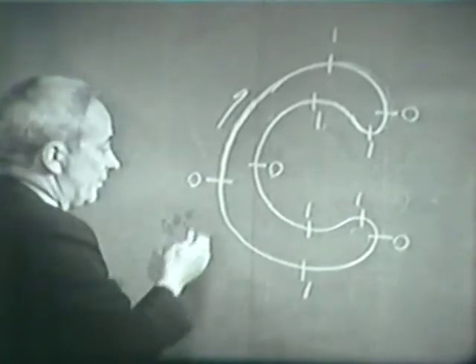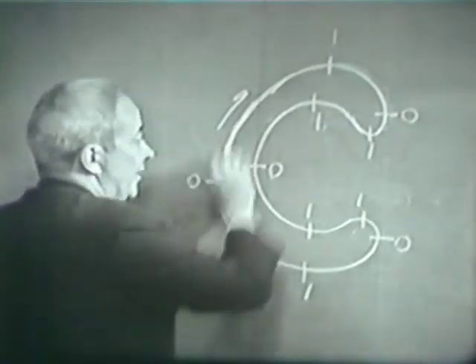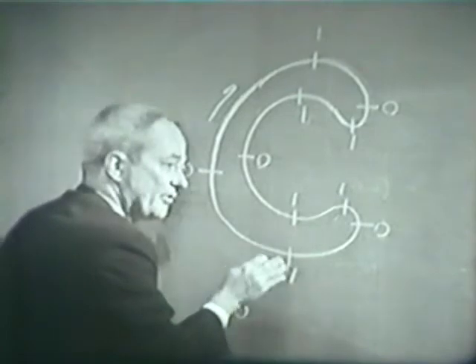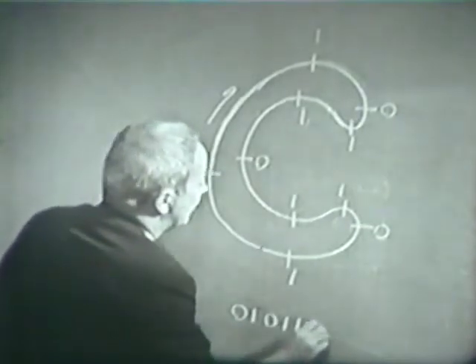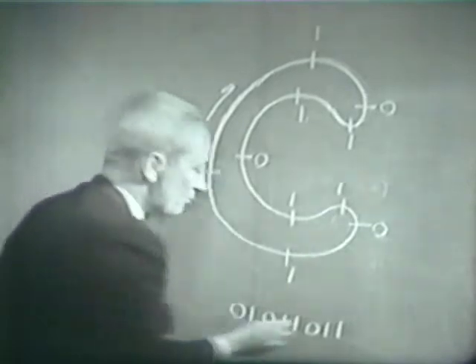Now, this scanner actually sneaks in from the left and finds the letter, and then it starts around. So it would start out here, and it would go 0. This is all that would be retained in the computer, plus a little bit of other stuff that I won't go into. A 0, and then a 1, 0, 1, 1, 0, 1, 1. Now, that is called a code word.